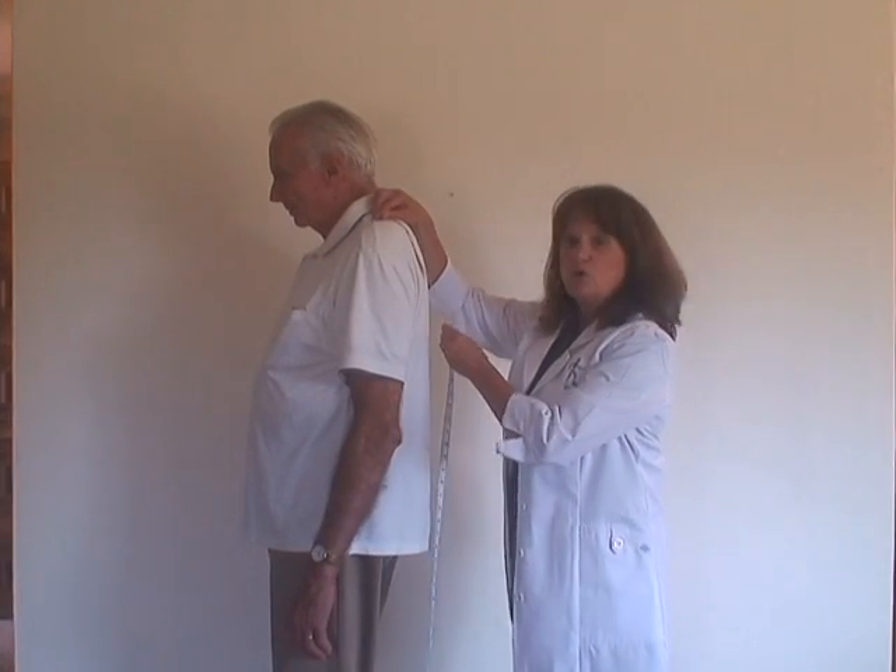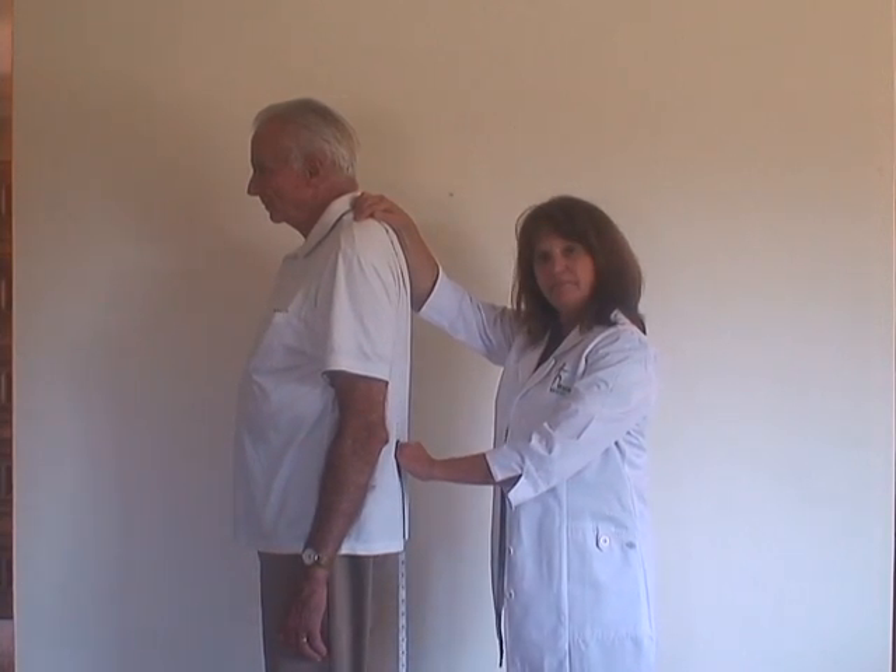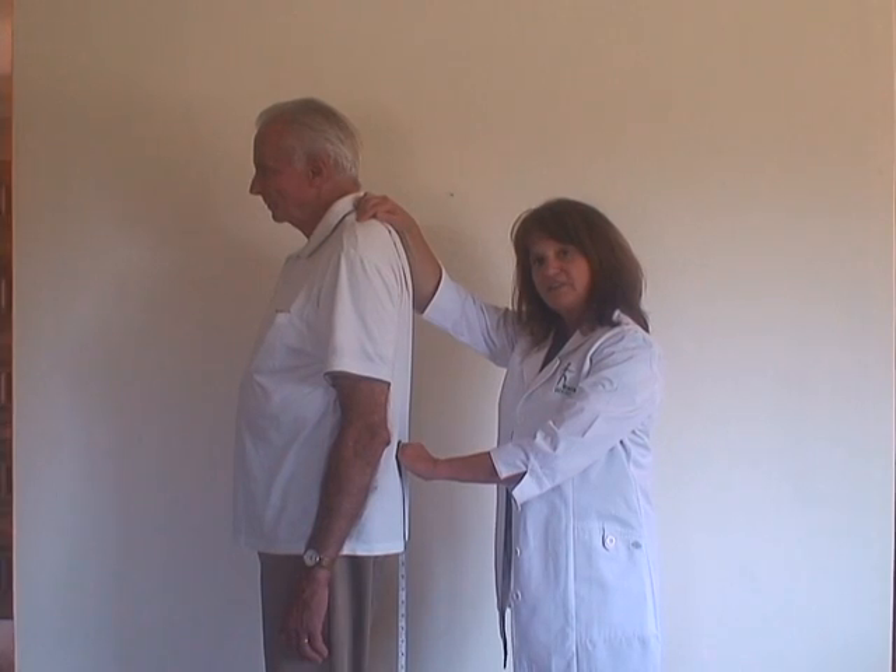You're going to record the number in the back, down just below the waistline, as far as you want the vest to go.